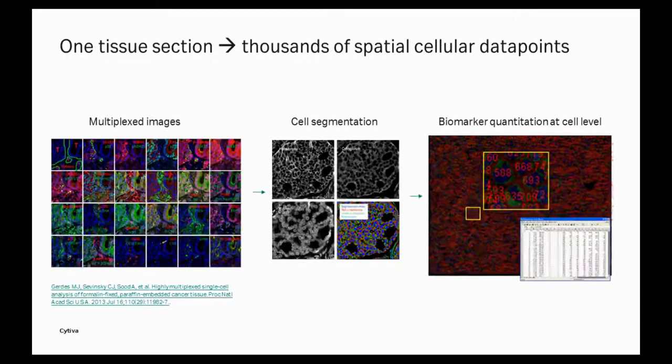So then we see an example from our publication back in 2013 in the PNAS, where we show this montage of 43 different proteins in colorectal cancer. And this was our first big publication, which we worked very hard at for several years to make sure we had covered all the bases and all the different aspects of the workflow, so that at that point we weren't just presenting a set of images. We also presented comparisons to some ground truths.